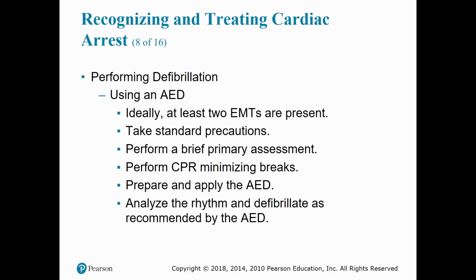Turn on the power to the AED. That's a big question. A lot of times they ask what is the first thing you do when operating the AED. Some people say put the pads on. Nope, turn the power on, because someone will tell you exactly what to do once you turn the power on. Continue chest compressions while attaching the adhesive monitoring defibrillation pads. Minimize any interruptions to chest compressions, and follow the manufacturer's instructions for applying the pads, turning on the power, and pad placement.